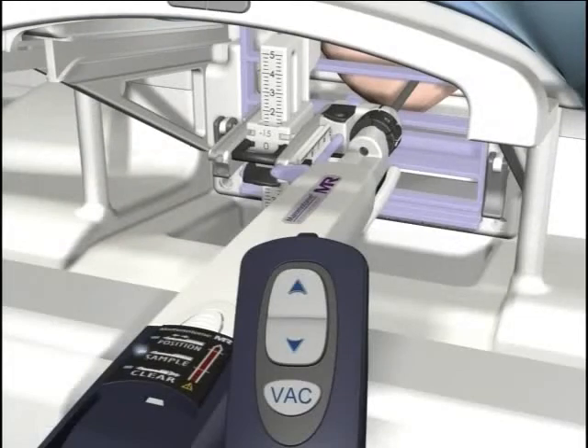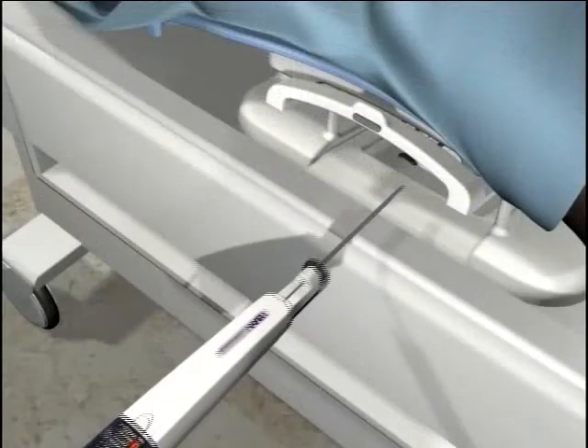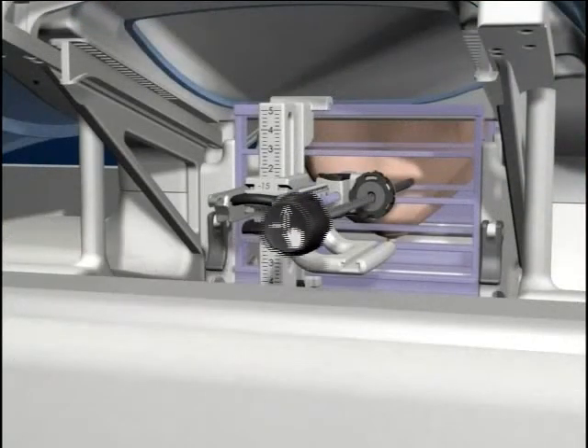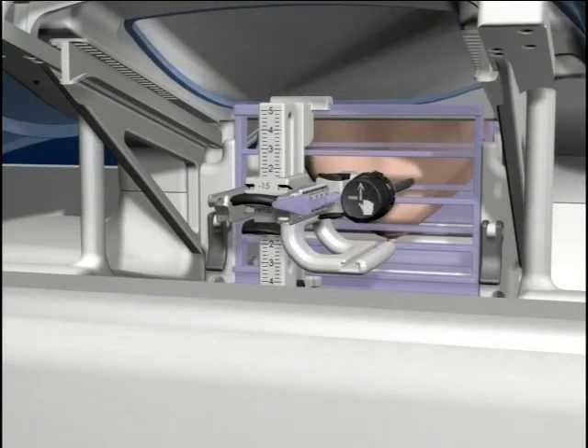When sufficient samples have been taken, remove the Mammatome holster and replace the tip protector. Reinsert the obturator stylet and cap assembly to close the opening in the sleeve.